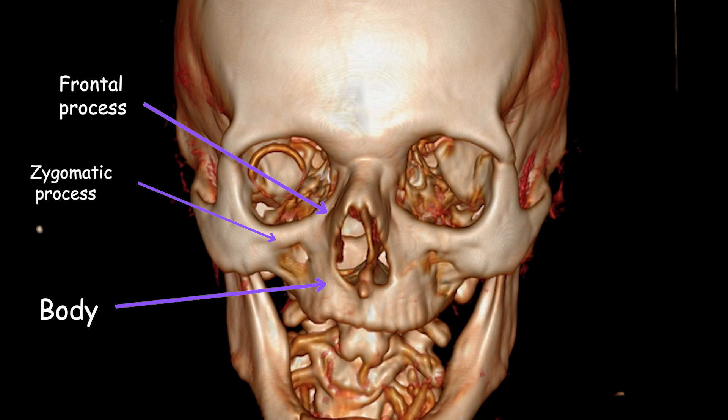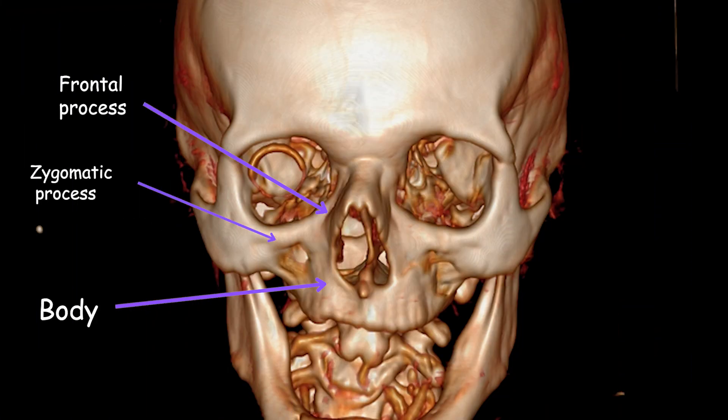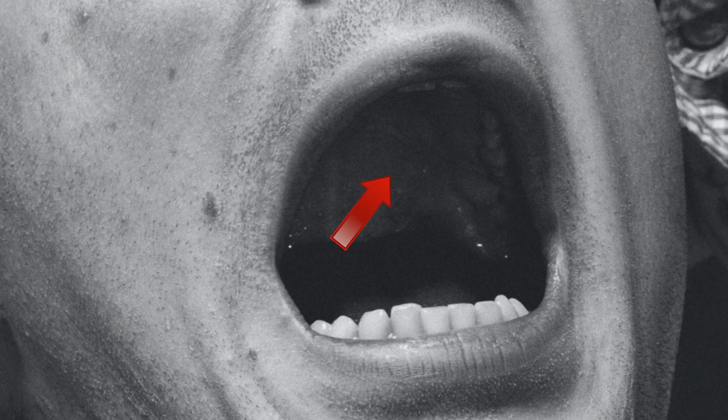The body of the maxilla forms the majority of the bone and contains the sockets for the upper teeth. The frontal process extends upward and contributes to the medial wall of the orbit and the lateral nasal wall. The zygomatic process projects laterally and articulates with the zygomatic bone, forming the prominence of the cheekbone. The palatine process forms the anterior part of the hard palate, contributing to the roof of the mouth.